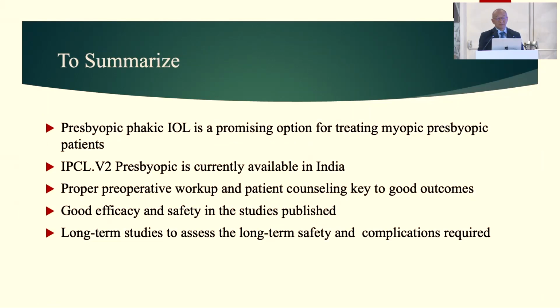To summarize, presbyopic phakic IOLs are a good option if the patient is willing for this intraocular surgery, and gives a very acceptable distance, intermediate, near vision for these patients. The only consideration is, if the pupillary shape changes, then the patient can have a difficulty of glare and halos. If your pupil is normal size, the patient is quite comfortable as such. Little bit of contrast changes can be there that can be managed by increasing the reading light for these patients also.